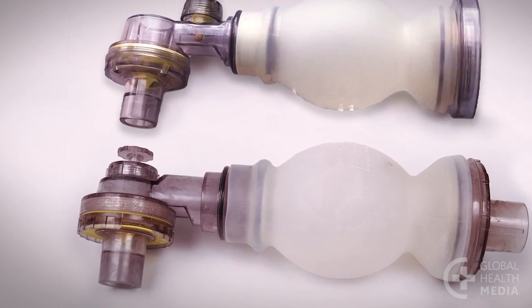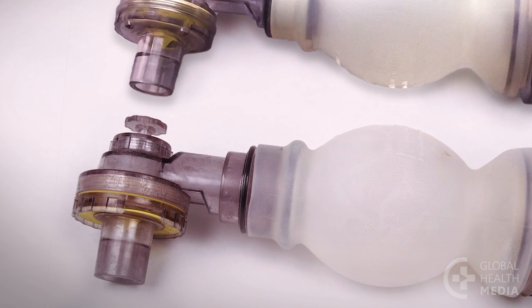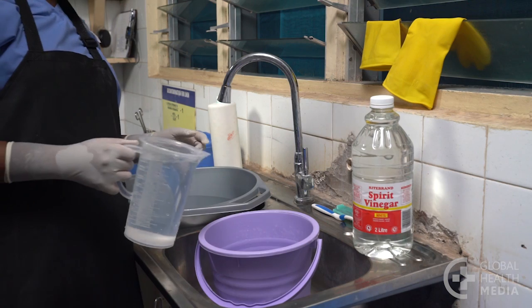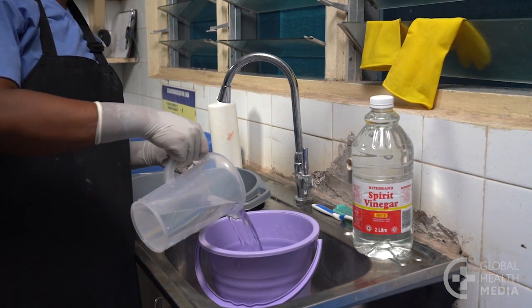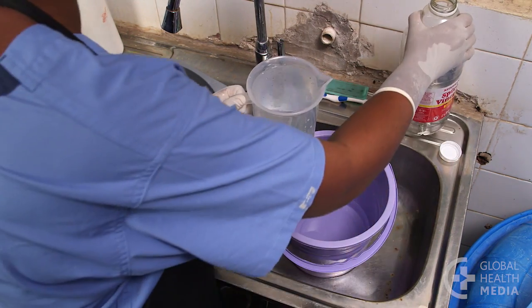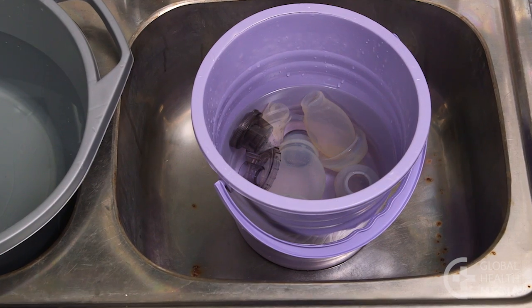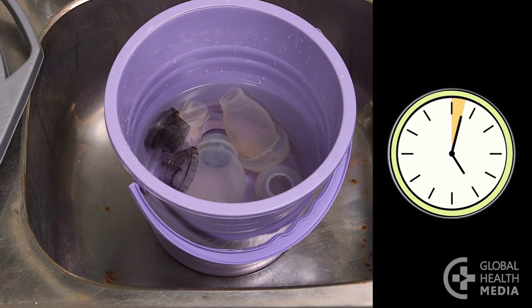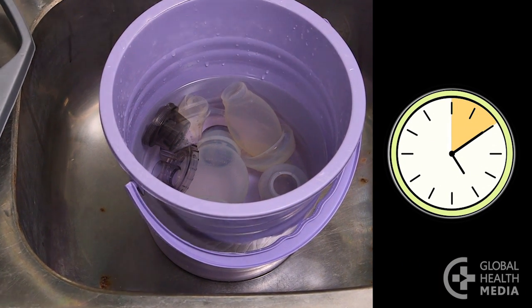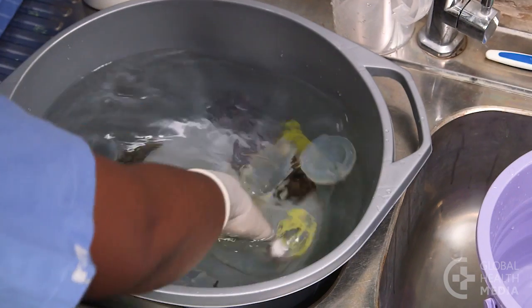If you see a light chalky material on the equipment, it's likely to be a build-up of minerals and should be removed. Make a solution of equal parts water and white household vinegar. Soak the submerged pots in the solution for ten minutes. Then rinse them in a bucket of clean water until they no longer smell of vinegar.